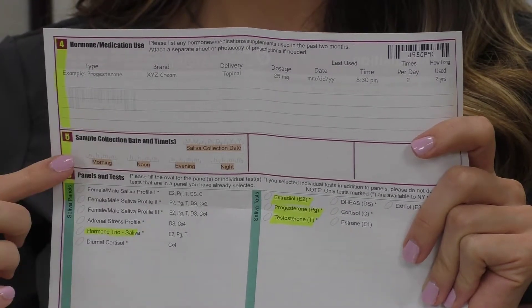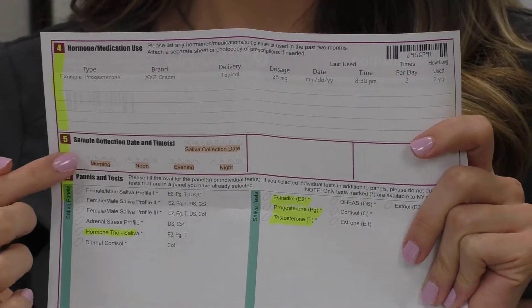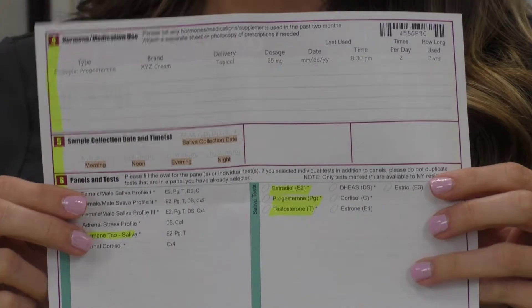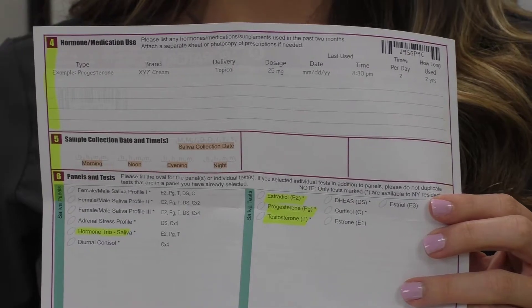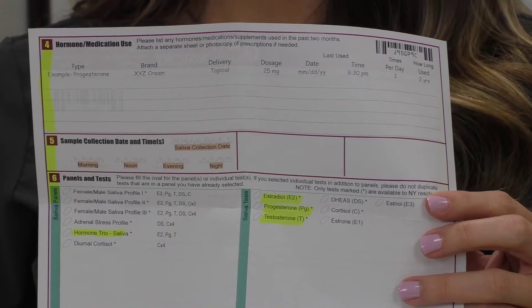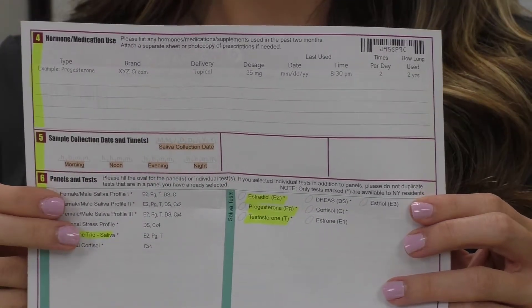Then underneath in this section is when you take your sample of saliva — you're going to put the date and the time that you take that sample. In this category down here, we're going to be selecting what hormones we're testing through the saliva sample, so it could be all three — estrogen, testosterone, and progesterone — or we could select the individual samples as well.